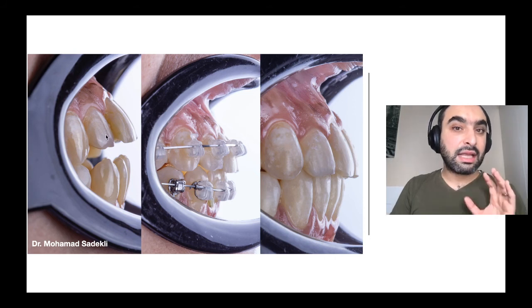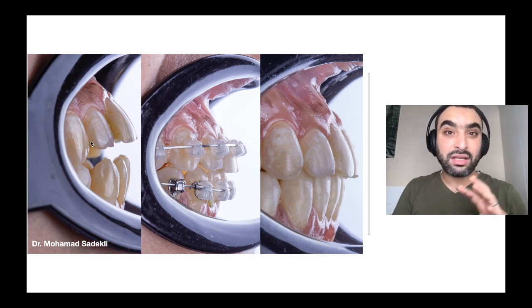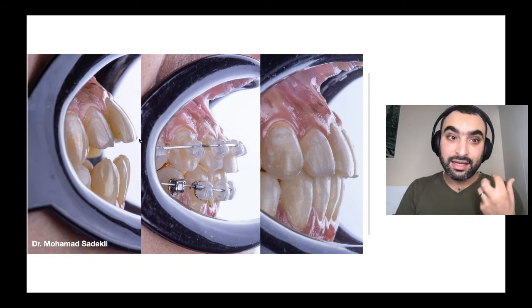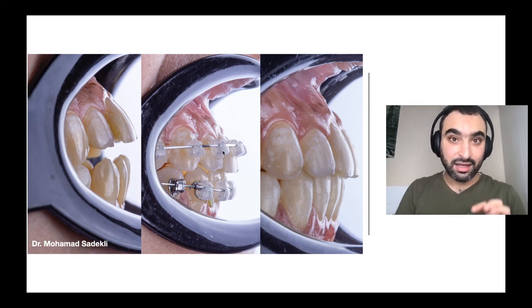But for this patient, the smile line wasn't good when I started. When she was smiling, the upper teeth were not properly showing.